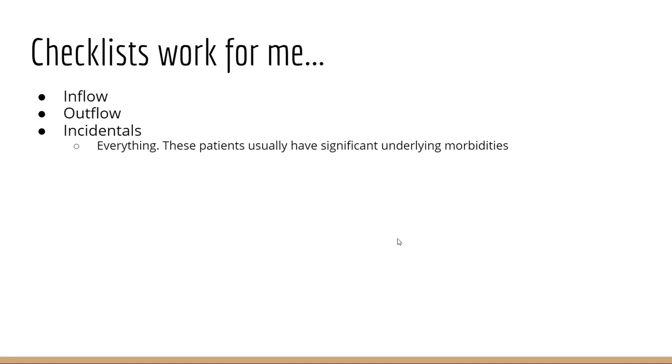Incidentals, unfortunately, these patients are typically pretty sick at baseline. Their protoplasm is poor, and they've made some life decisions that perhaps they regret in terms of smoking and diet. So there are often underlying morbidities, and I don't think I've ever seen a CT runoff without at least one incidental.